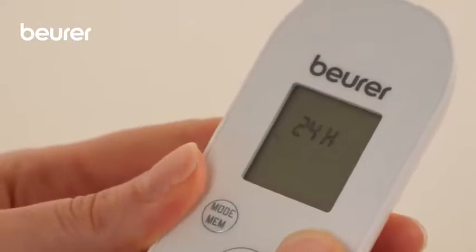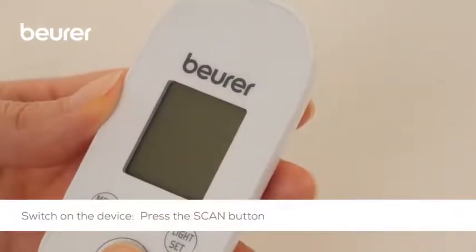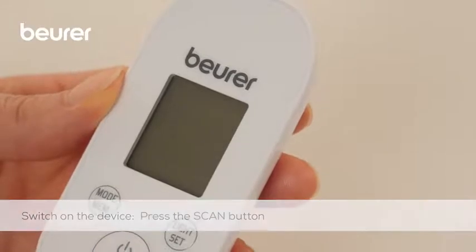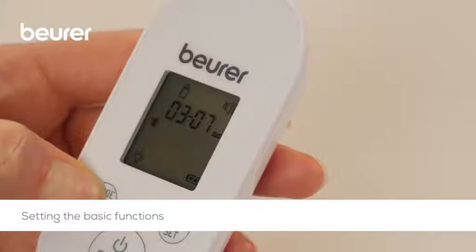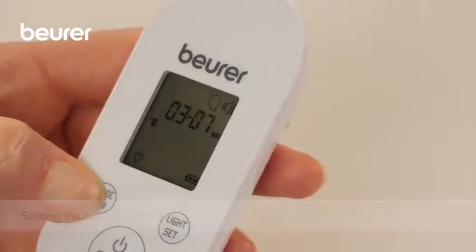To switch on the thermometer, briefly press the scan button. Use the mode MEM button to set the individual parameters and confirm with the light set button.